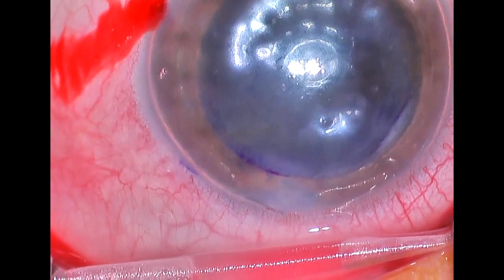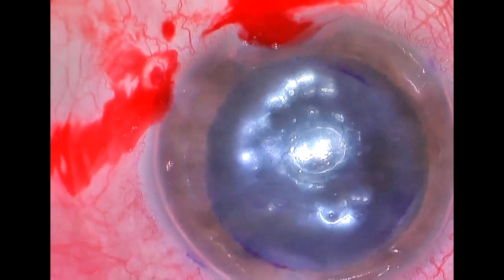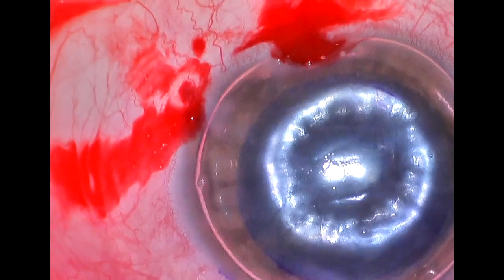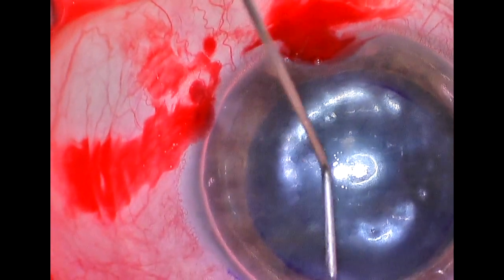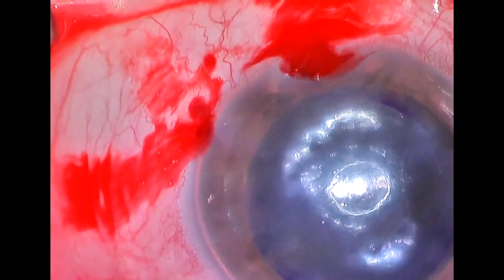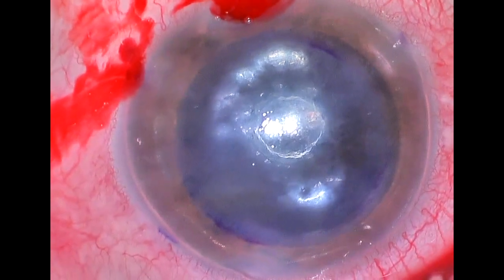It's important to make sure pressure is appropriate because we're going to leave the air in the eye for approximately 60 minutes and then let about 25% to 35% of the air out. That will allow fluid to flow through the peripheral iridotomy we created with the scissors earlier in the case, enabling good fluid flow from the posterior portion of the eye to the anterior portion. Here we are checking the pressure and making sure it's not too high.